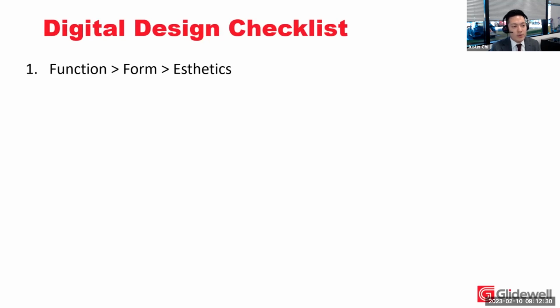The form and the shape of our designs and restorations need to be related to our restoration's primary function, which is to serve our patients, improve their chewing efficiency, certainly holding the space, and speech as well. We're going to focus mostly on posterior today, and then the aesthetics really fall in line with those key criteria.